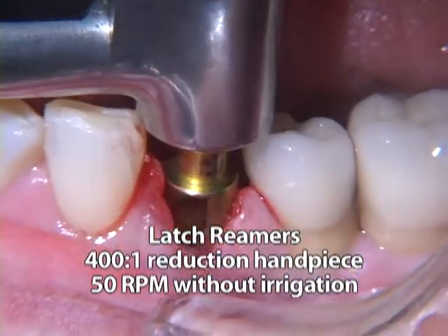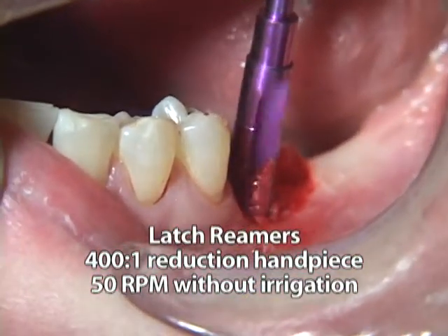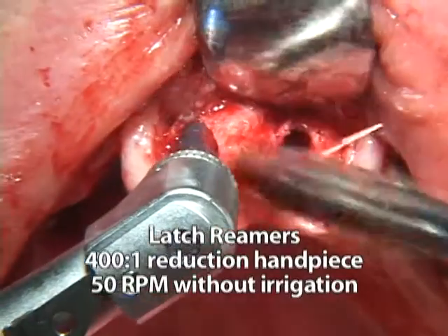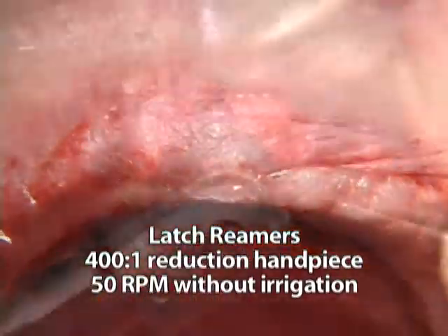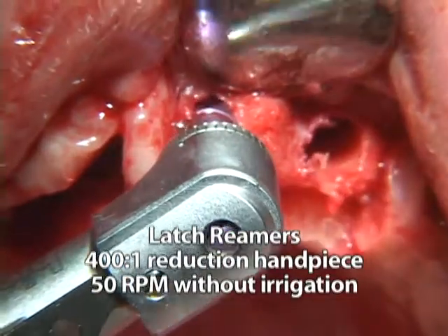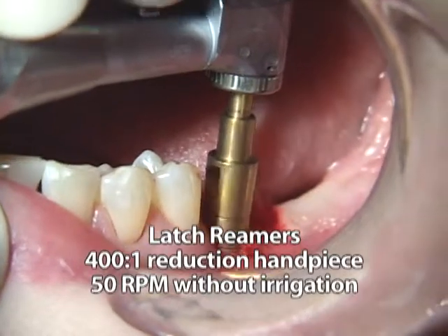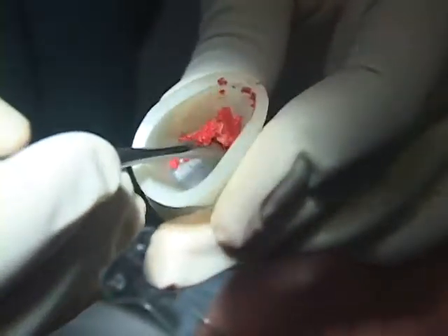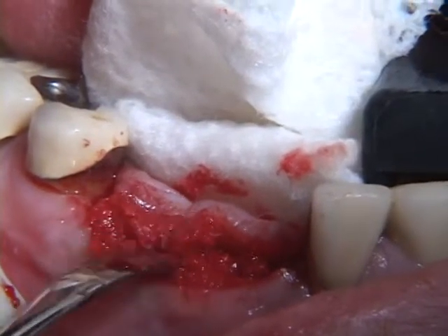In order to prevent bone shavings from clogging the flutes of the reamers and overheating the walls of the osteotomies by burnishing, the reamers, while continuing to rotate, are intermittently withdrawn from the osteotomy for the harvesting of bone from their flutes. The harvested bone is collected in a flexible silicone dappen dish for its use as an autogenous graft over the seated implant.